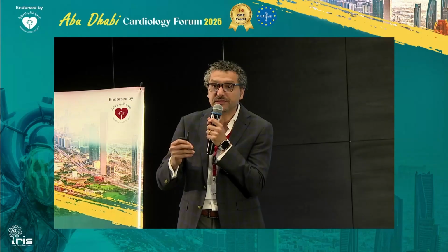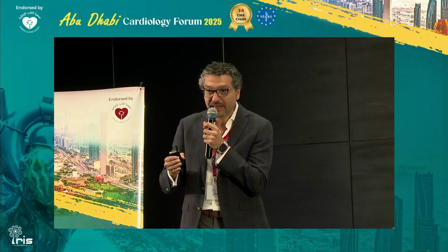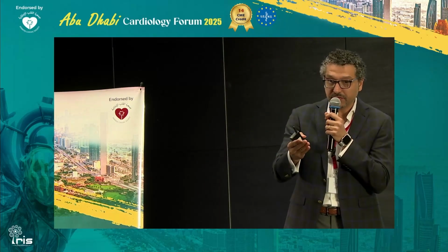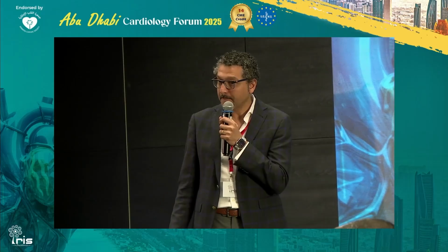I mean, was it just a dysfunctional valve after the surgery or what? Because it's a bit weird, after 10 years, he gets this kind of paravalvular leak, right? So I agree, the surgery was the option. After the heart team, we said that surgery is the best option. In the absence of infection, abscess, and any other reason, probably an occluder will be okay.